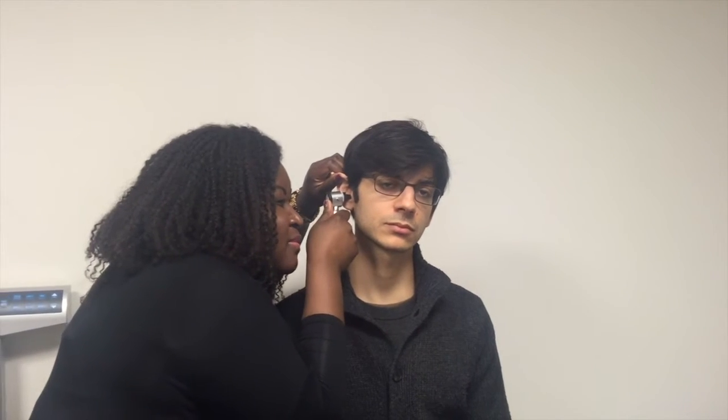Next, examine the ears. Inspect the auricle and push the tragus to assess for tenderness. Using an otoscope, inspect the canal, tympanic membrane, and the integrity of the ear. To assess cranial nerve number 8, perform the whispered voice test. If there is suspicion of hearing loss, perform the Weber and Rinne tests. Please refer to your SOP for explanations on how to perform these tests. Good. Any tenderness here? No.